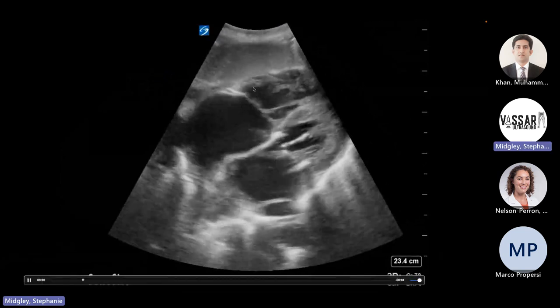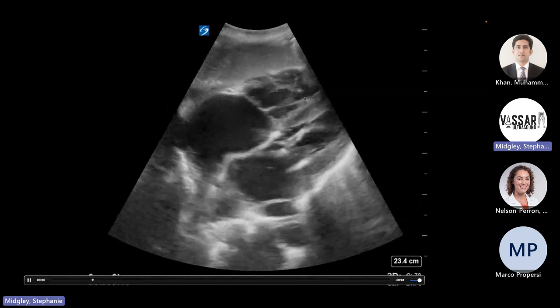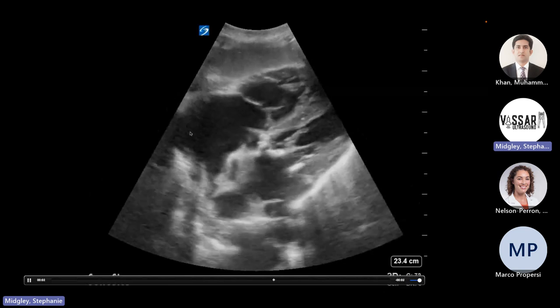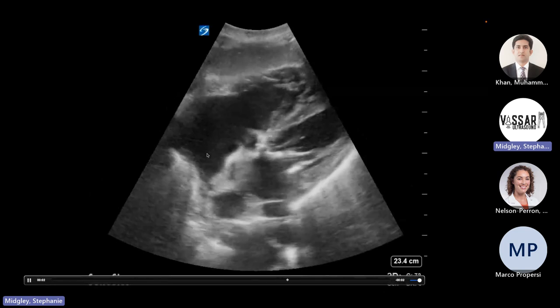Some clues for pulmonary hypertension: if the RV wall looks really thickened and very trabeculated and muscular, kind of like the left ventricle, then it's a little more likely something chronic. Also, if the right atrium is really big, it's usually had some time to distend.